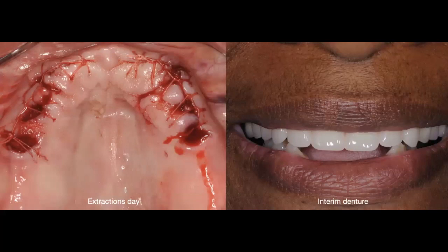I try to avoid using soft tissue conditioners by getting a very well-fitting interim denture base. I don't have anything against them — they're a good option — but they can become messy around healing alveolar processes after extractions. The better the fit of that denture base, the faster the delivery and the fewer adjustments needed. I extract, deliver the denture immediately with minor adjustments, and send the patient home.